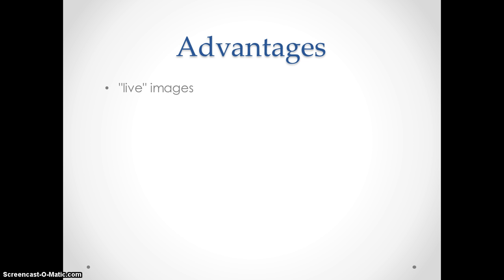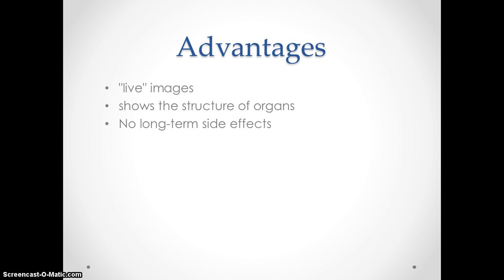Advantages. It produces live images and it shows the structure of organs and has no long-term side effects. It's widely available and not very expensive.